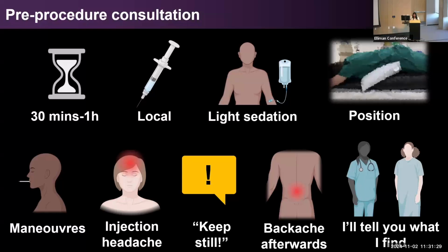I'll often explain any special maneuvers, and I often warn them that you can get an injection headache, and that can feel quite bad, but we try and take measures to avoid this. And then any time when I think that they're going to need to stay still, I try and reiterate the importance of that, how we're going to tell people, and then whether they'll experience any backache afterwards.